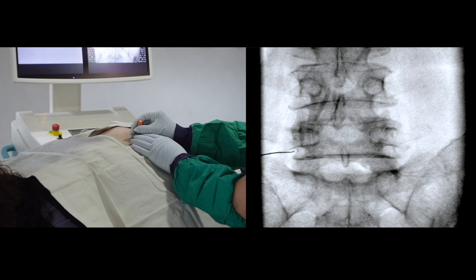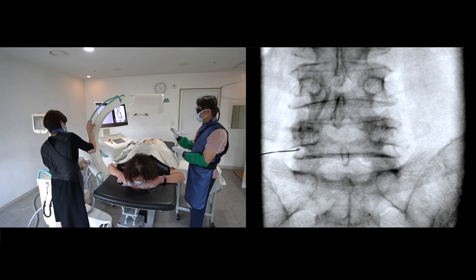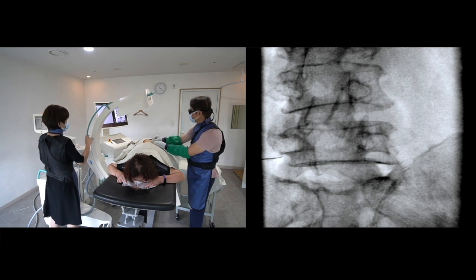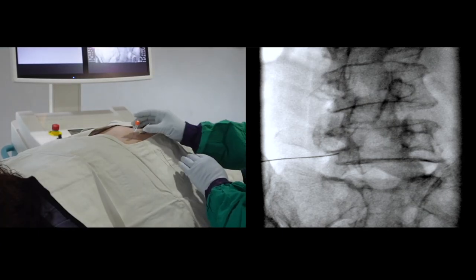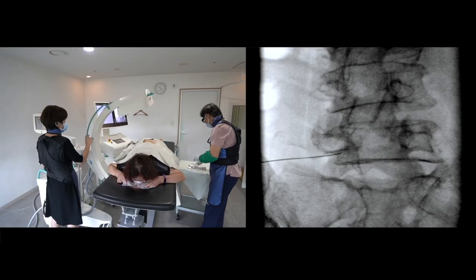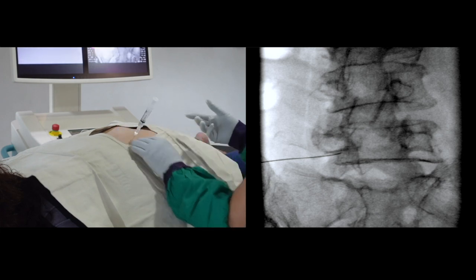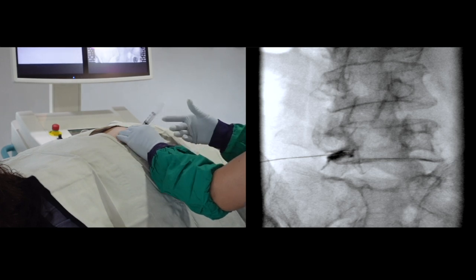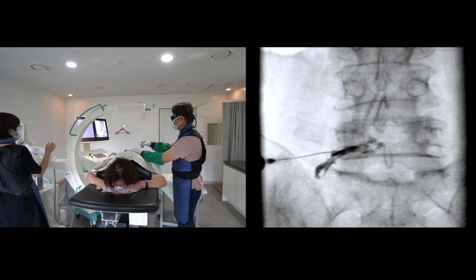It allows me to advance the needle close to the inferior border of the transverse process on AP view. Turning to the contralateral oblique view, nothing stops me from moving the needle along the inferior border. The contrast spread looks good. Let me turn to AP view.